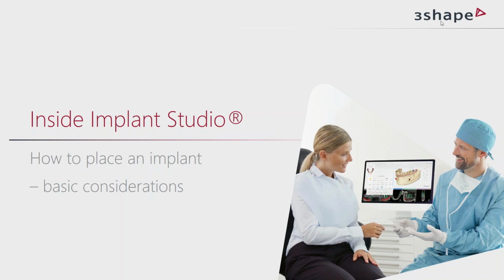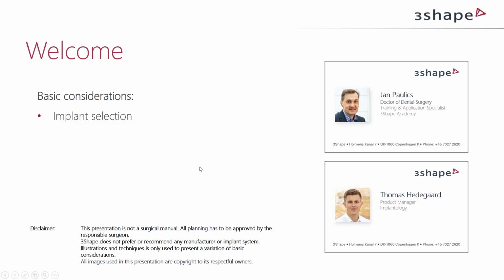and potential new users. So these are some of the considerations that we've tried to gather here today that we want to share. As always, you're more than welcome to ask questions. We will be monitoring the questions coming in the chat and in the question section on the webinar. So ask questions, and then we will either answer them as we go along if it fits in with the program, or we will answer them afterwards.